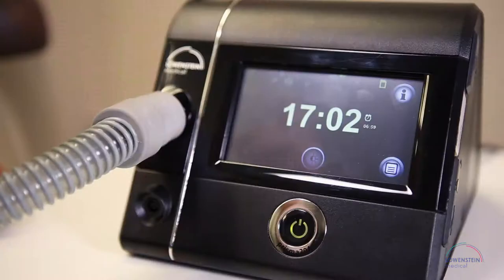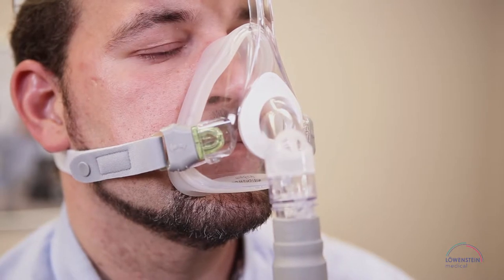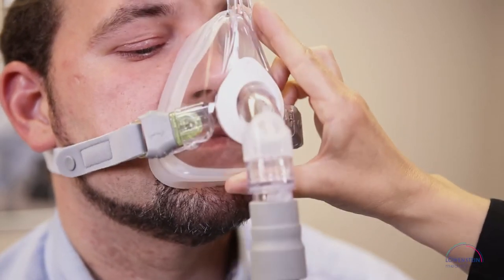The therapy device can be switched on with the on-off key, or the patient can breathe into the mask to activate the device with the auto-start-stop function.